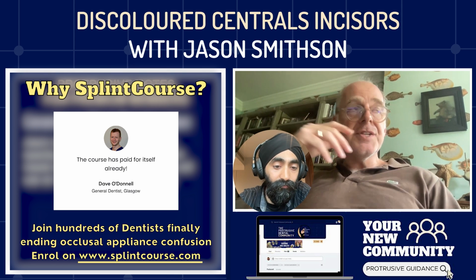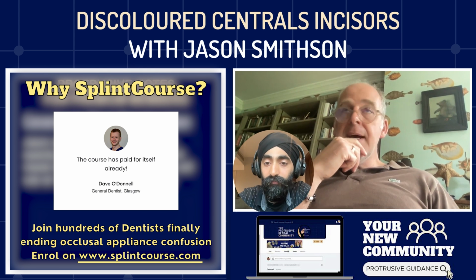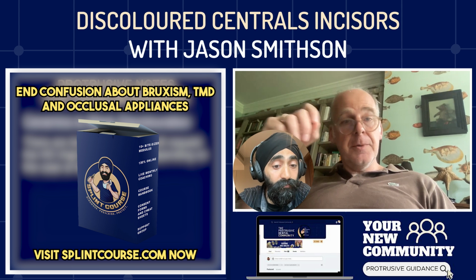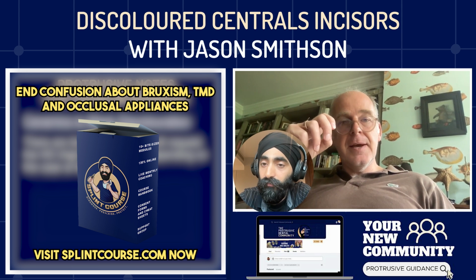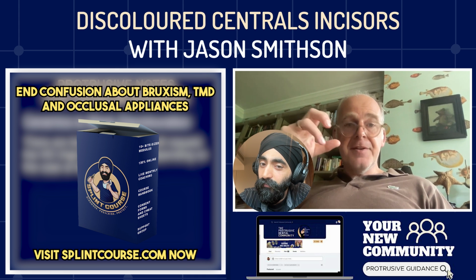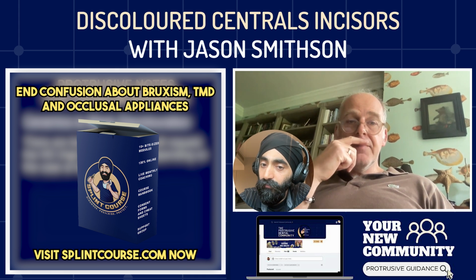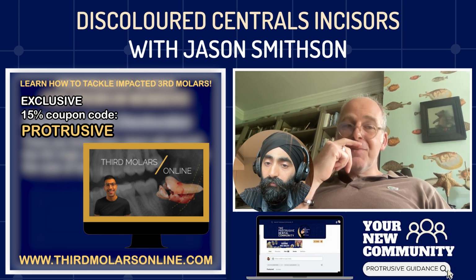And the reason why they use that is it's easier to handle for the lab in terms of layering and staining and glazing. But we occasionally will use the HO ingot, which is high opacity, for a veneer. But to be honest, if we're doing that much prep and the tooth is that dark, oftentimes we'll be doing a crown anyway. So then we can go back one, and we may even go down the zirconia route if we're doing a crown. That's probably a lecture in itself.